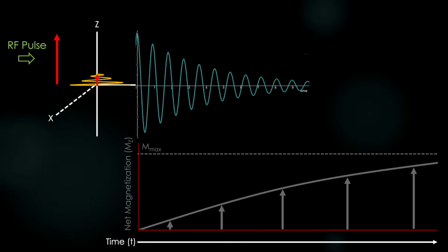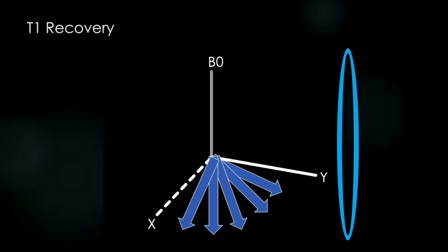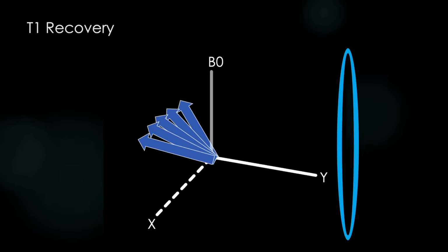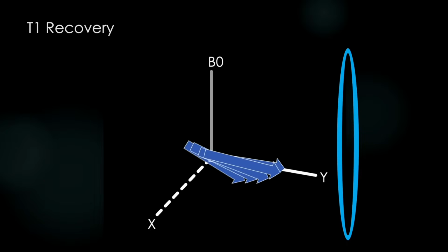We proved this in Lecture 1, and also hinted that this raises a perplexing question of what T1 is. We know it means something, and we have T1 weighted images, so what is it? This is the question we're now going to answer. But you will never again fall for this animation, right? You will recognize that these processes, T2 decay and T1 recovery, are separate, and that T2 decay happens much faster than T1 recovery.